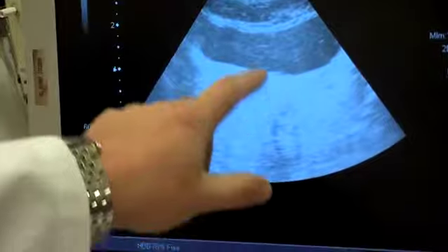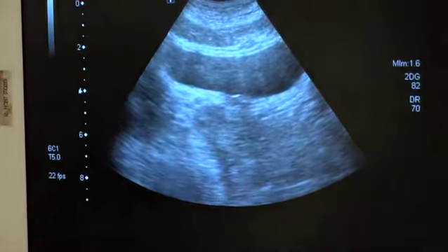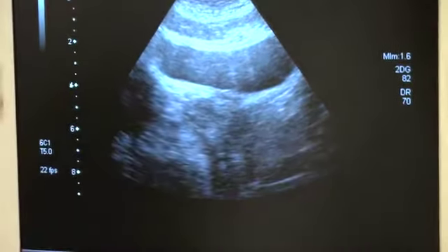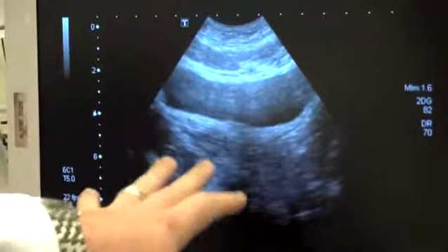But if I'm moving all the buttons just here, I'm compensating for deeper echoes and making it less bright in the far field without changing the overall uniform brightness of the screen.